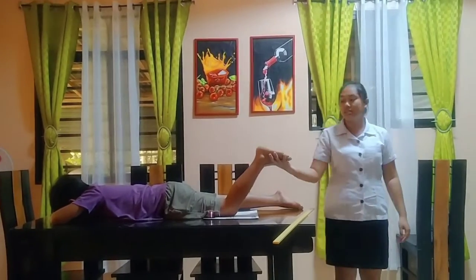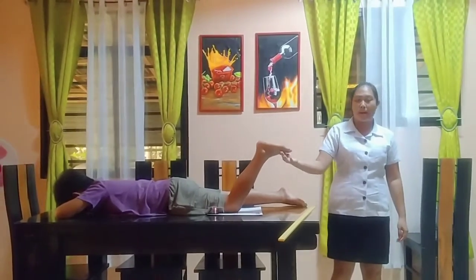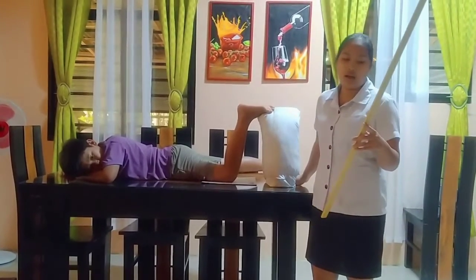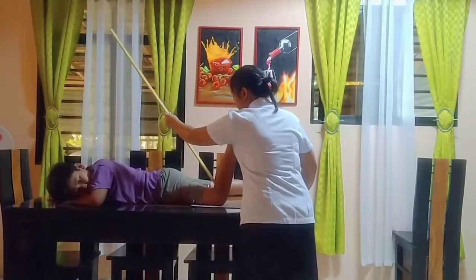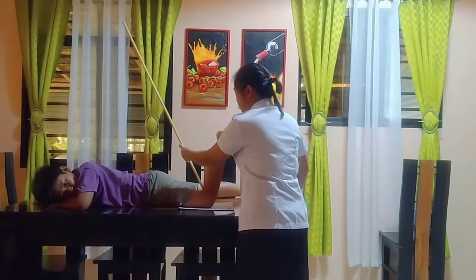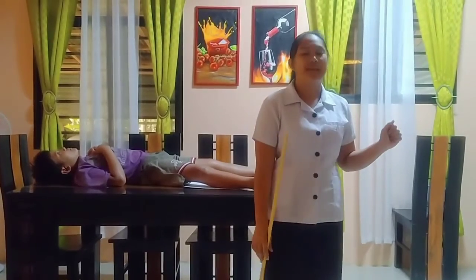Now, for the patient's comfort, kailangan po natin ng sponge para patungan ng paa ng pasyente. So, now, the central ray will be angled 40 degrees toward the lower leg. 40 degrees. Shows the intercondylar fossa free from superimposition and intercondylar eminences.